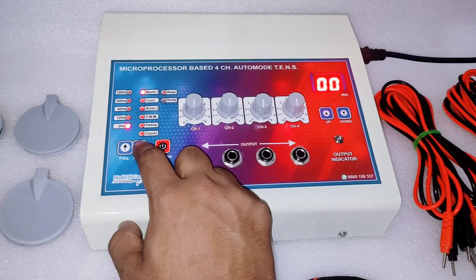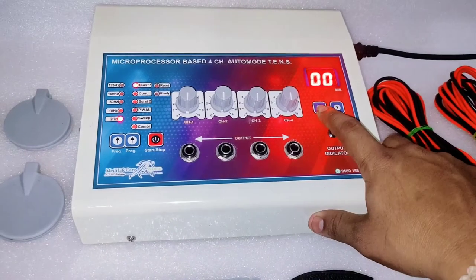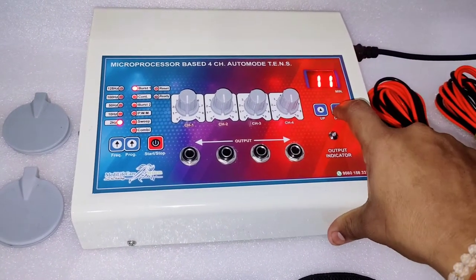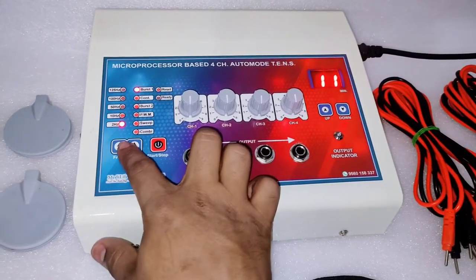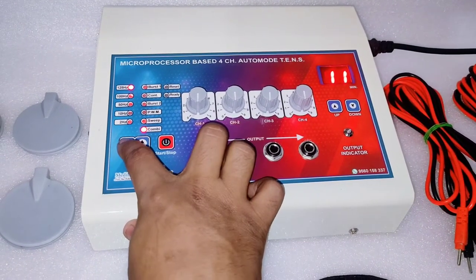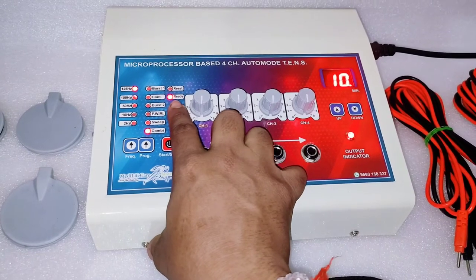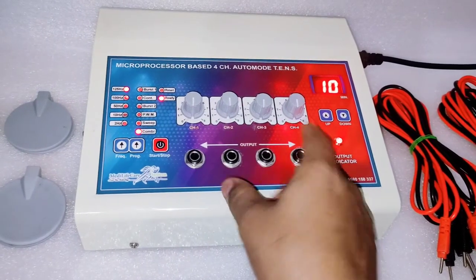These are the programs. For starting any program, simply increase the timer. This is the decreasing timer. This is the decrease button. For starting any program, just select a program, then set the frequency, then start the machine. Whenever it starts, there is a light which shows ready and the indicator will blink.